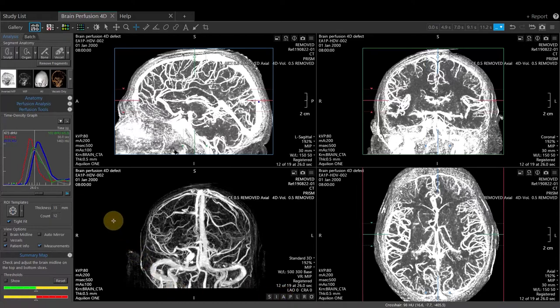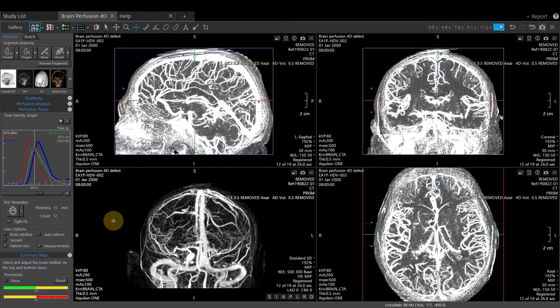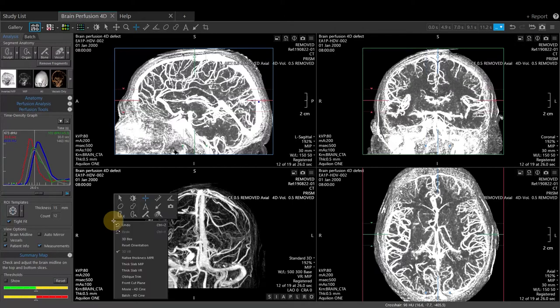If desired, rotate the image around to a different projection. Right-click again and select Batch 4D Cine.